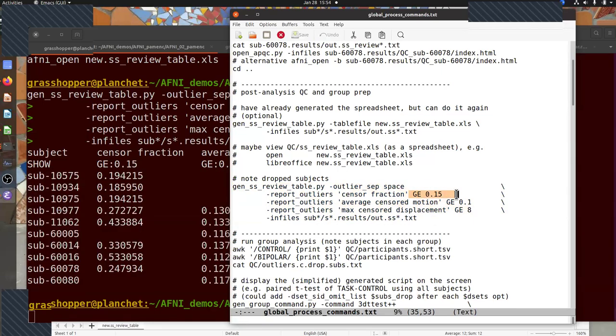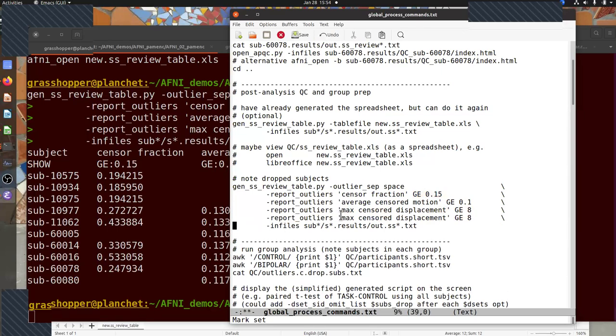These are kind of absolute quantities. We also have ones that are based on z-scores across a distribution of properties. You can do this based on voxel size. You can also ask, did something vary across subjects? So, for example, are you worried that you used different versions of software across subjects and you want to make sure you use the same one? You could do something like, I'm not going to get it exactly right, but it's going to be like AFNI version vary.